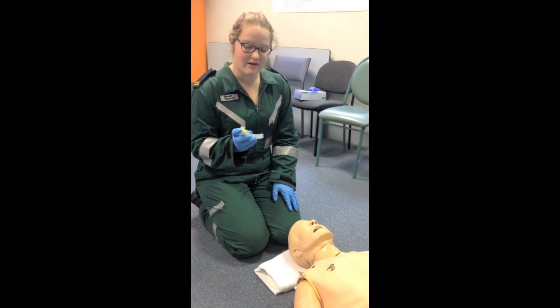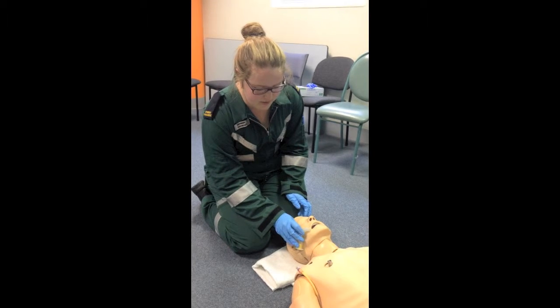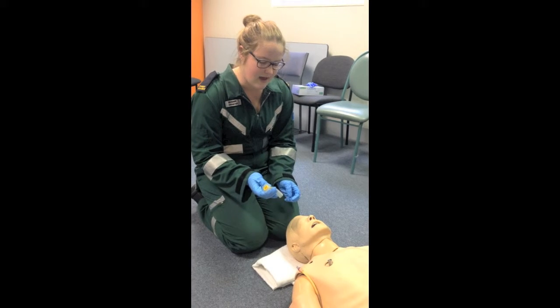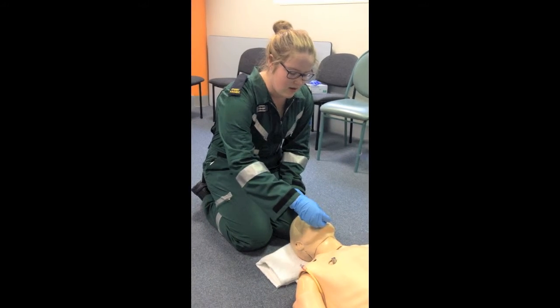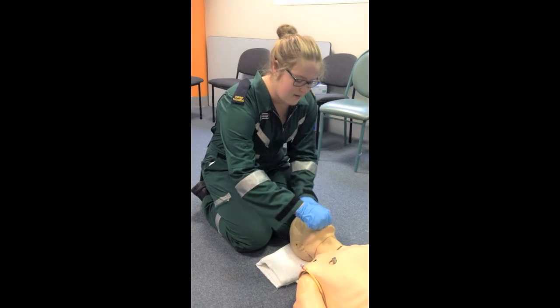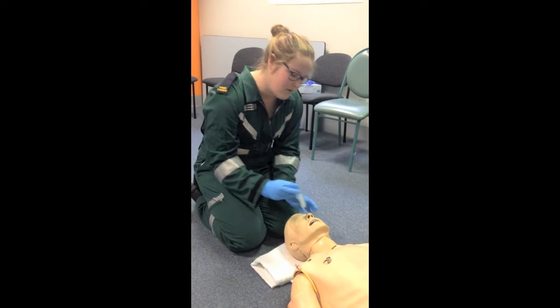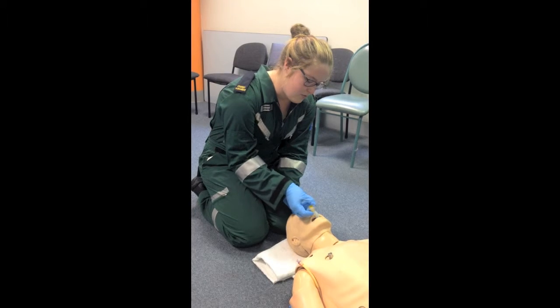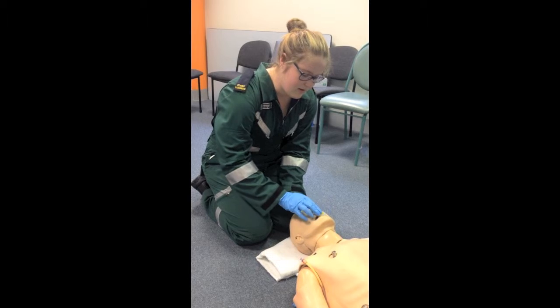To measure an oropharyngeal airway, you go from the angle of the jaw to the corner of the mouth. A common error when inserting an OPA is just sticking it right in and not using the twist. This can damage the airway. So to insert it correctly, you have it at a 180-degree angle and insert it to the back of the tongue and then twist, and it should go in smoothly. And then you check that you have a seal.